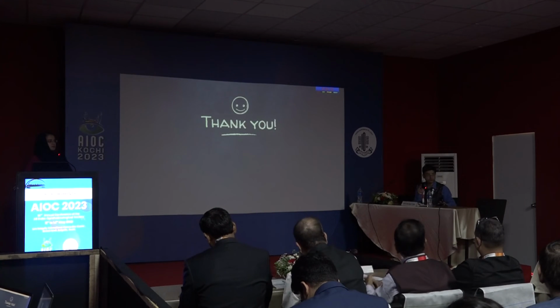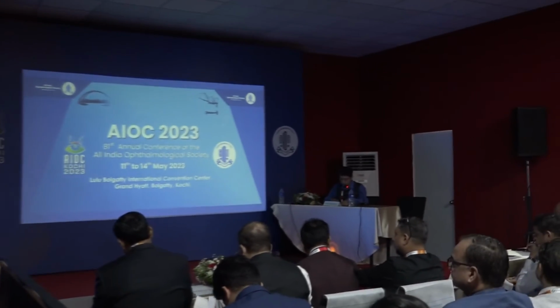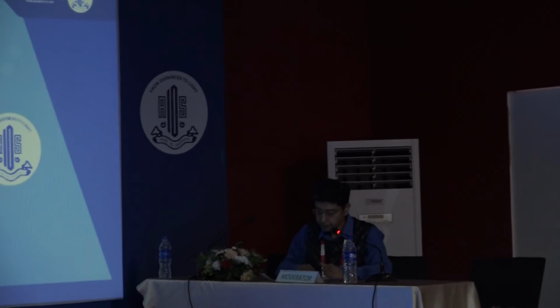What is the difference with our regular suction machines? One thing is the cost. The regular suction machine costs around 20,000 to 25,000, and this is less than 1,500. And the tip of the regular suction apparatus is made of metal, which may get blocked, and it is very large. And this is a simple IV set, which is easily available and can be easily maneuvered.